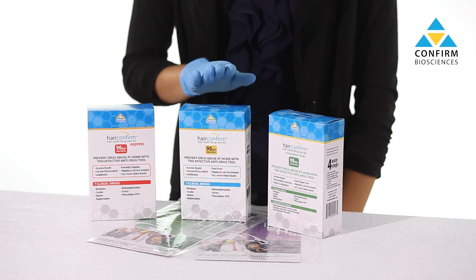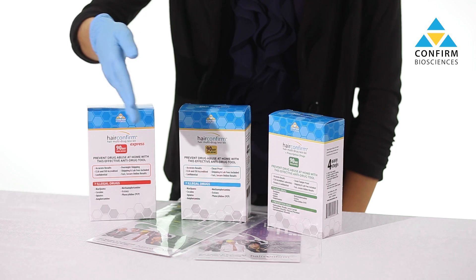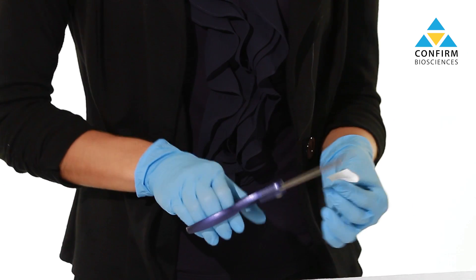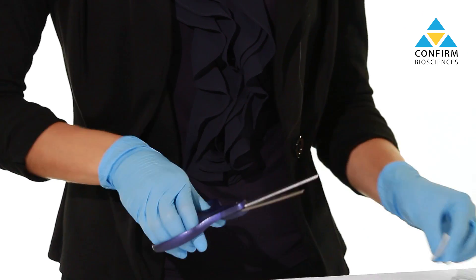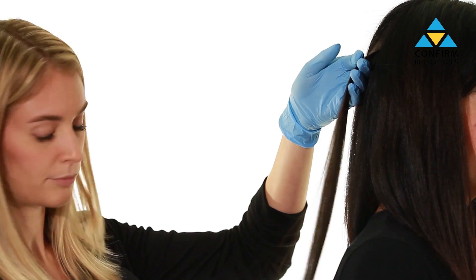Including standard, express shipping, prescription drugs, and business-specific. Begin the test by wiping a pair of scissors with an alcohol wipe. Next, select at minimum a half-inch long strip of hair equal to the diameter of a pencil.